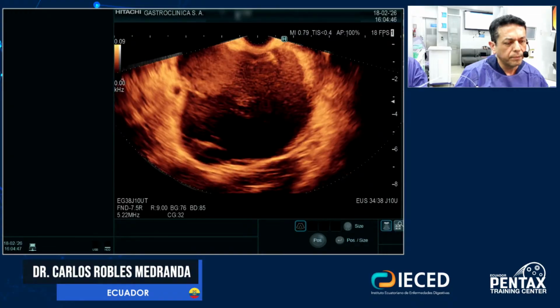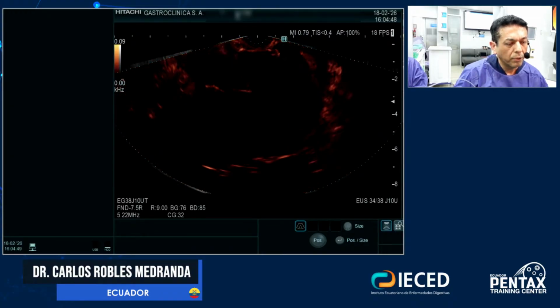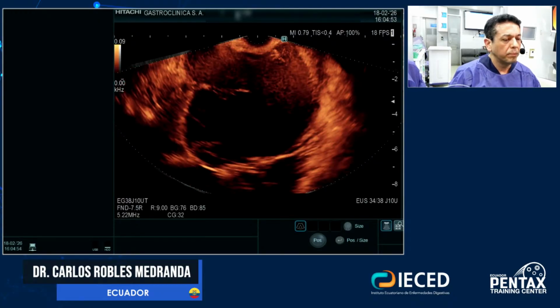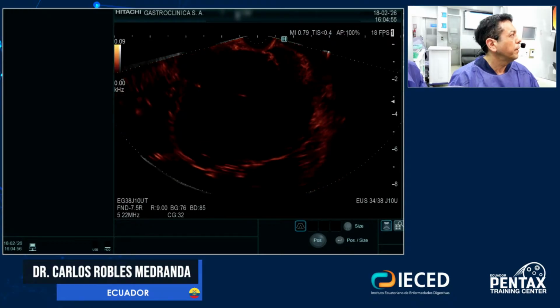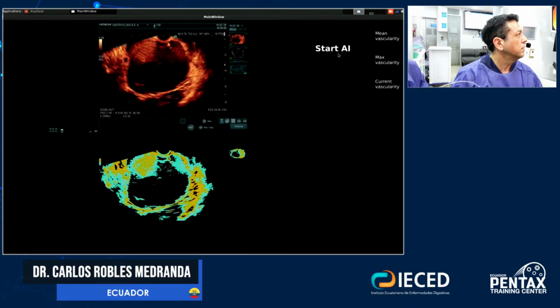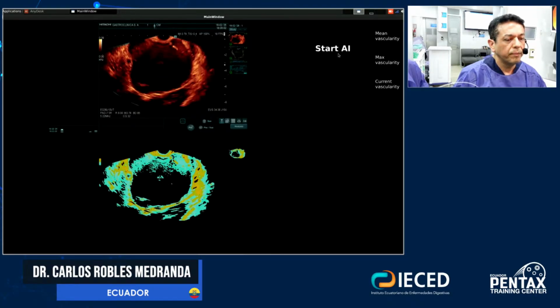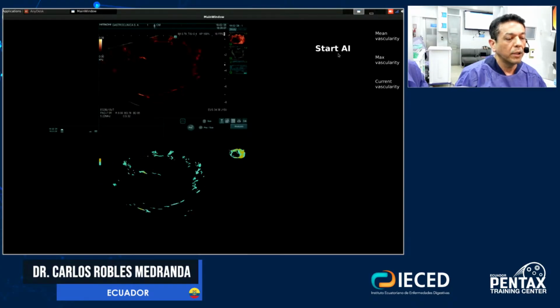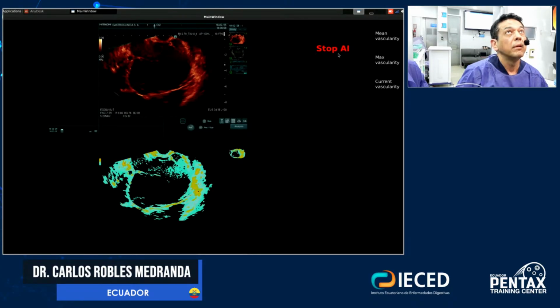Now I want to show you AI technology. Can we turn it on, no, wait. Can you make the AI bigger? Okay, so now we have this technology that helps us evaluate the microvascularization that we are seeing in the lesion. Okay, can you put it on? Start. No, we have to reset.